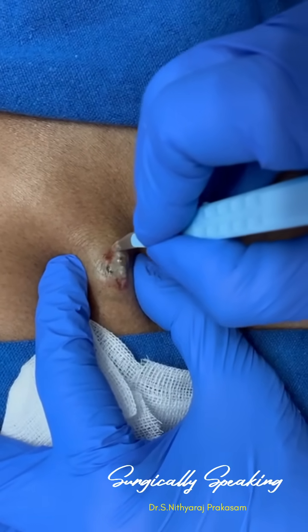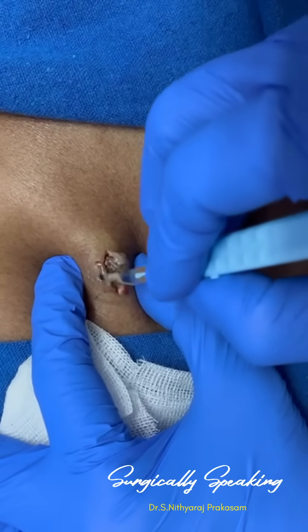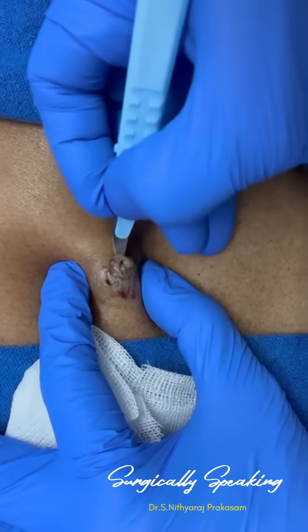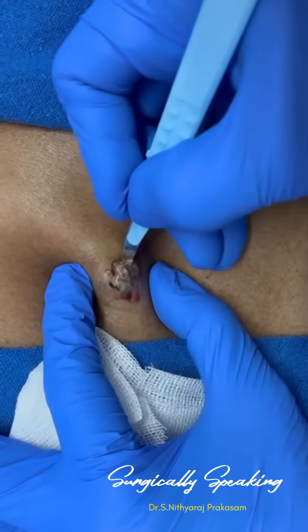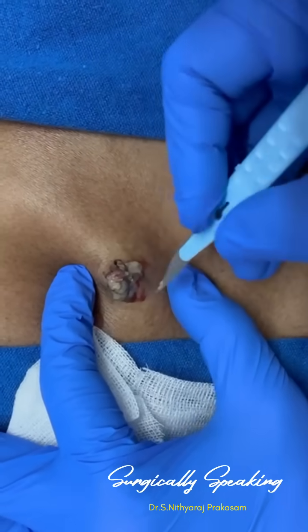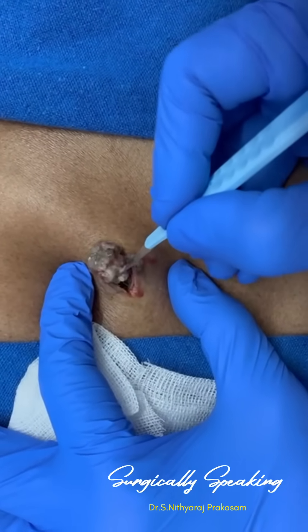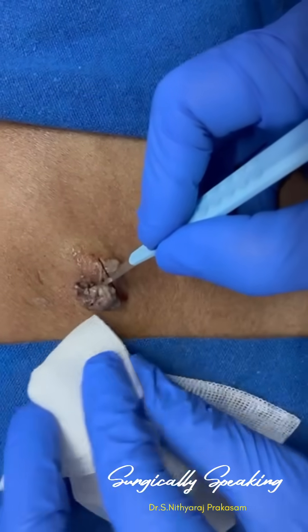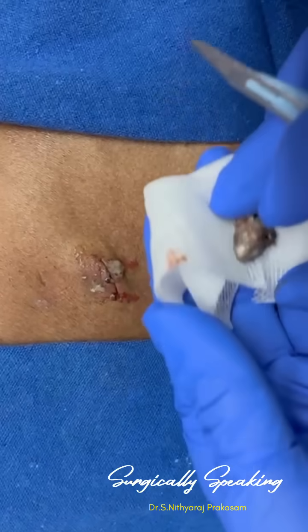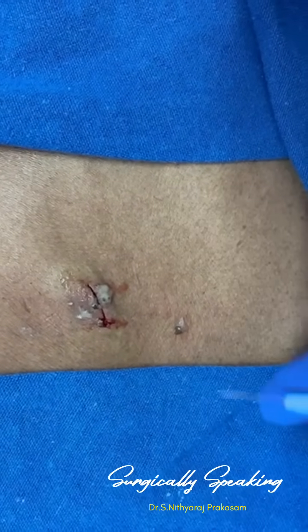Okay. So that much only needs to be done. Needn't be very aggressive here. Just the decompression will give the patient immense relief. You can see this is the content. That was the content. And now one more gauze.